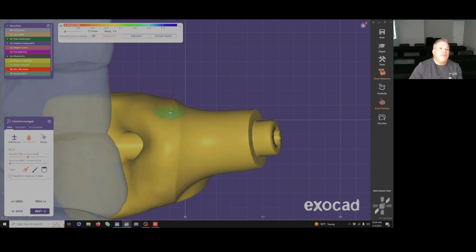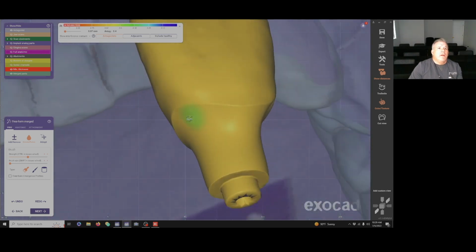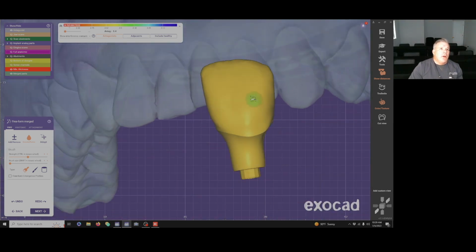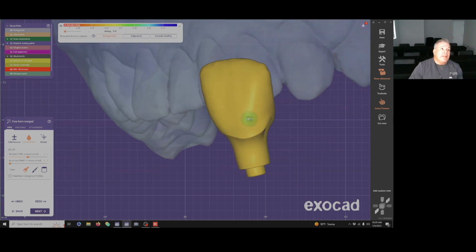Now, when would you use this? You could conceivably use it if you want to use a connection with zirconia. I don't personally do that. The time that I would use this is if I was doing an immediate implant. We can print this out of some 3D printing material in our office, a material that the tissue doesn't respond badly to.